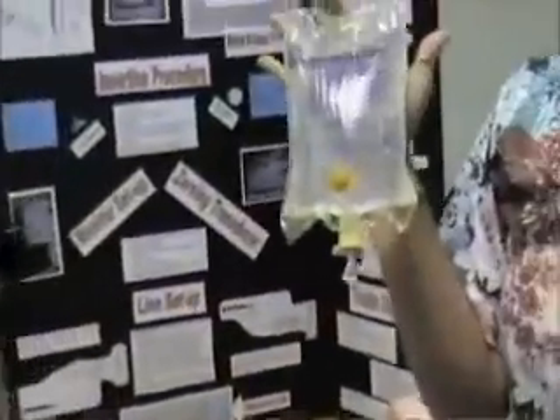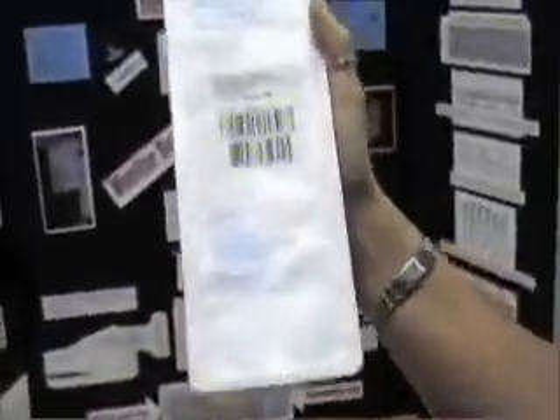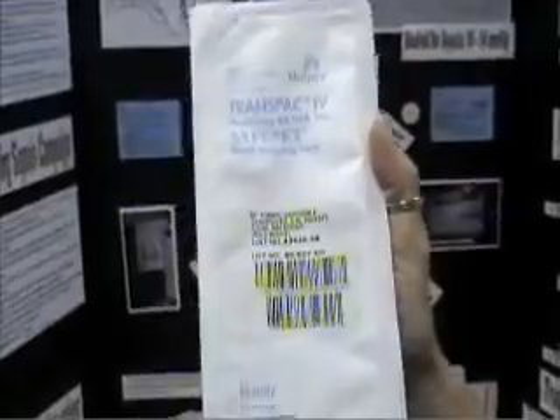The supplies you're going to need are a 500 cc bag of normal saline, pressure tubing, and a pressure bag.